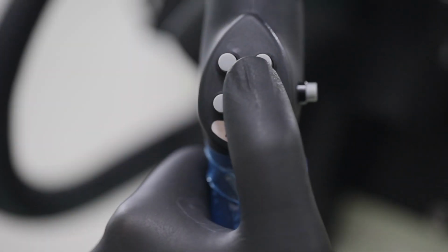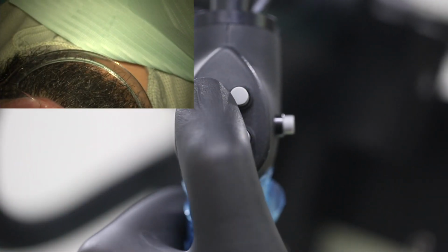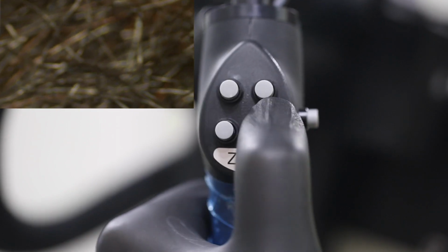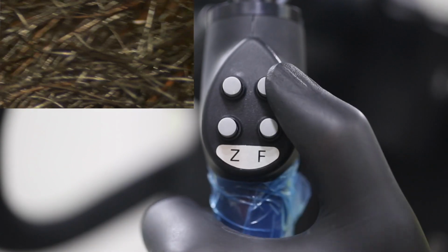But in the Leica microscope, because you have a large field of view, you can zoom and focus easily. And here in this video, I chose to focus on the beard of the patient to show you how you can focus on every single hair you want to see.